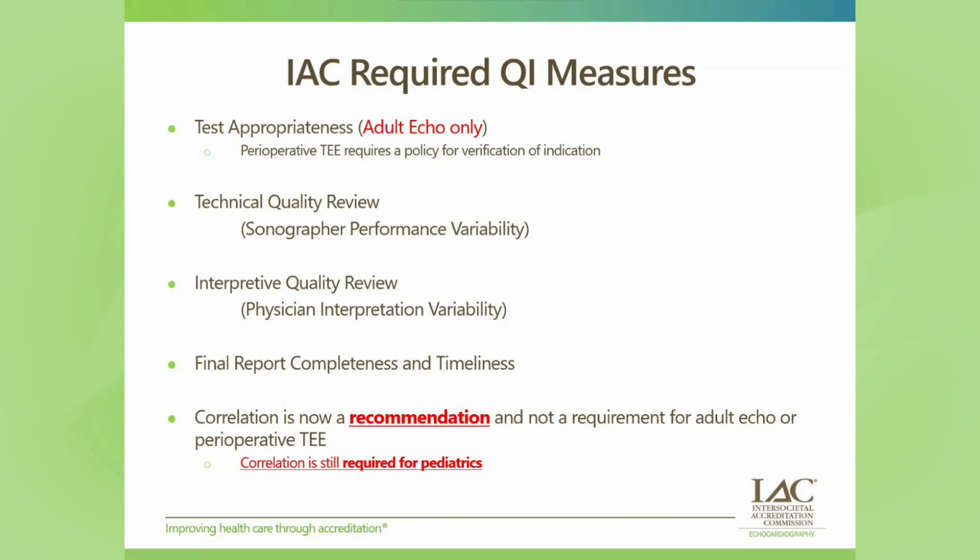Next would be technical quality review. This is sometimes known as the sonographer's performance variability. A technical quality review is looking at image acquisition. Were all of the images obtained? Was the protocol followed? Is my technical quality good? Should I have used ultrasound enhancing agent? Should I have adjusted my color box? Is my depth too low or too high?